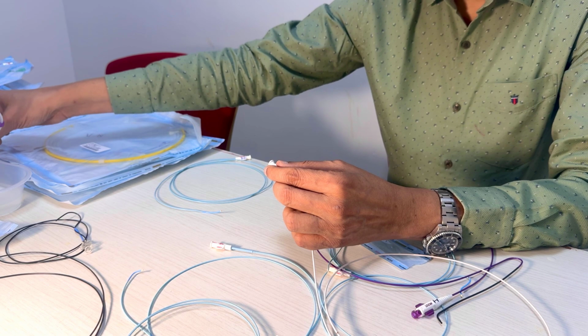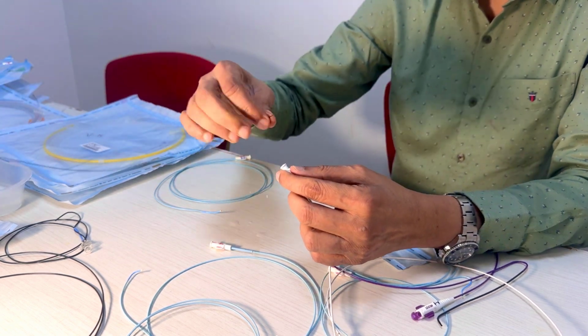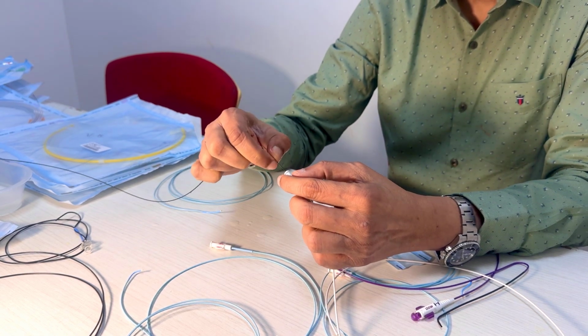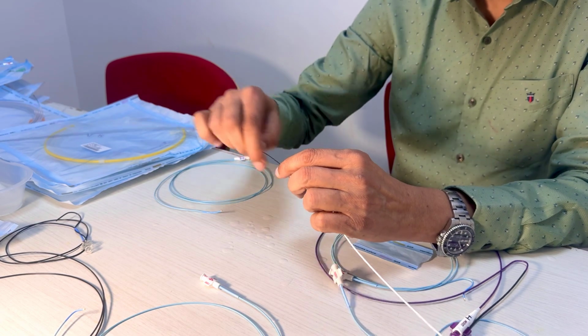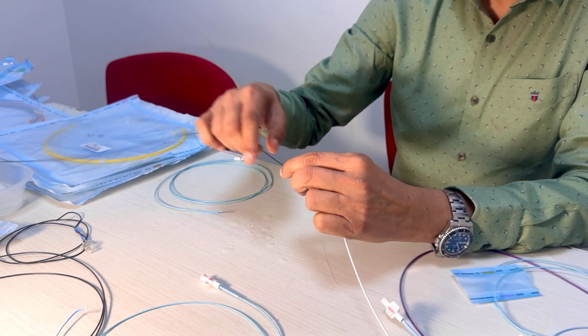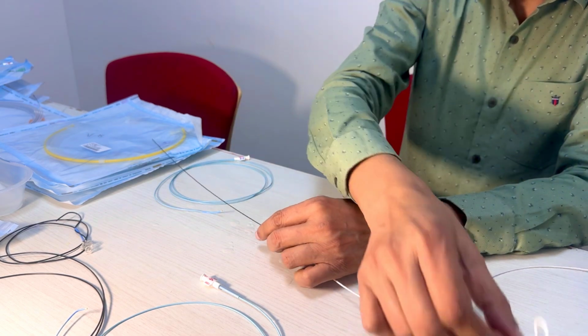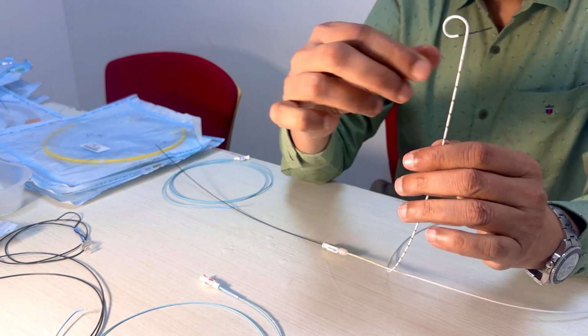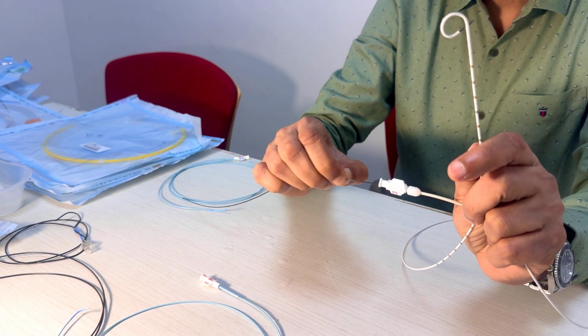As you know, these soft coated wires will never cross unless they are very, very wet and lubricated, right? So this one basically has a hydrophilic coating, and I'm getting this wire. In a minute, I'll show you exactly what happens. So you see, can you see this? Though the wire is coming out, the shape is retained, right?